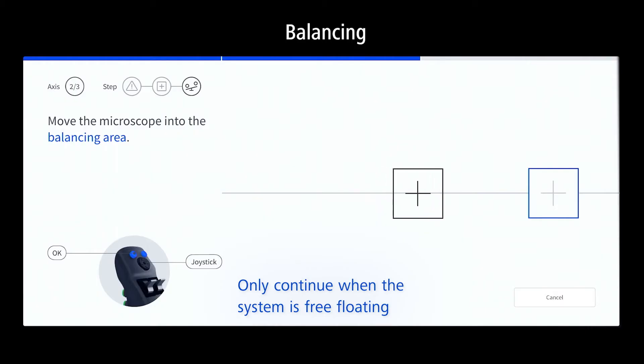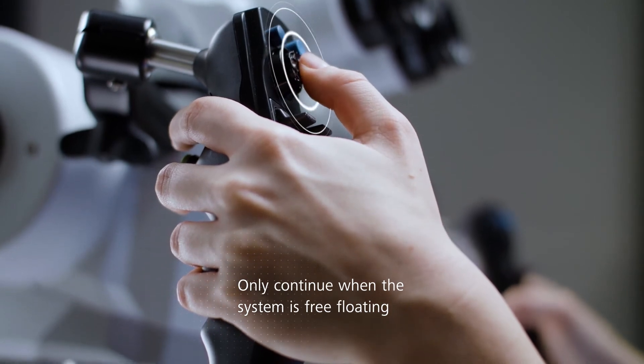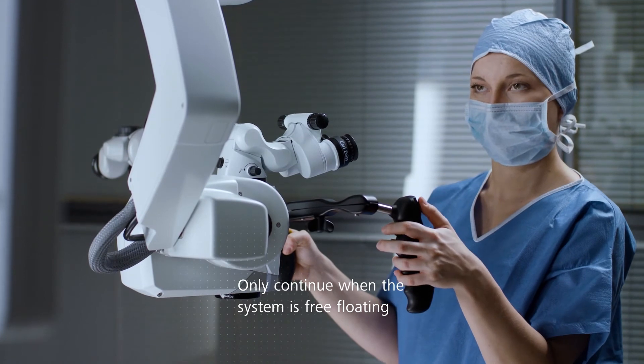Move to the second spot and check the balance. Adjust the fine balance by tapping the joystick left or right. When balance is reached and the system is free-floating, continue with OK.